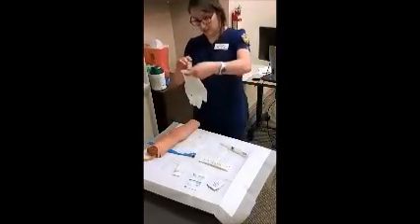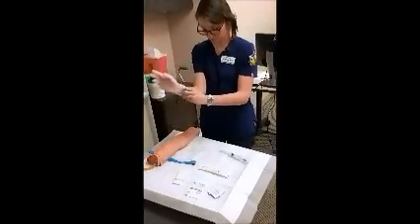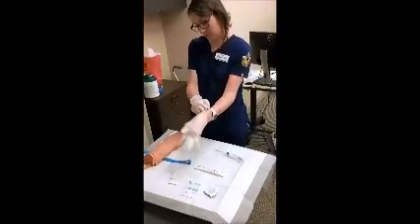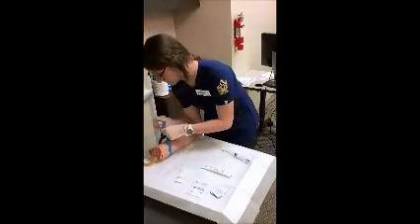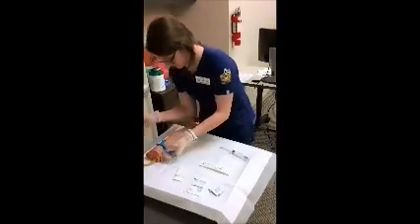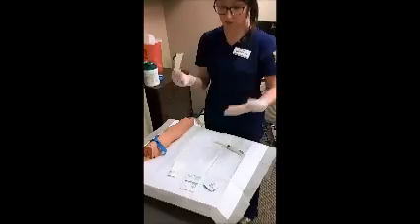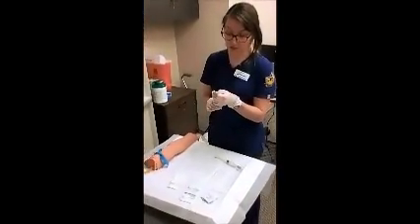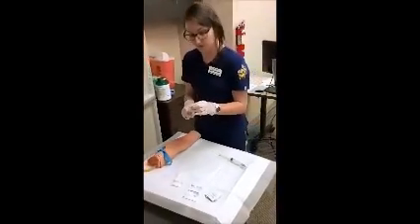I'm going to go ahead and put my gloves on. We'll tie up our patient again here. Now, we're going to double check. We've already verified expiration dates on everything else, so we'll just double check ours on our IV catheter. This one does say 8/2017, and so in reality I would get another IV catheter. For now, this will do.